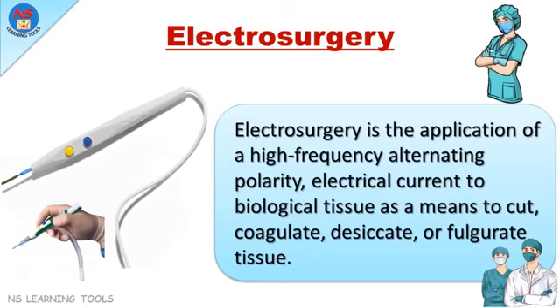Electrosurgery. Electrosurgery is the application of a high-frequency alternating polarity electrical current to biological tissue as a means to cut, coagulate, desiccate, or fulgurate tissue.